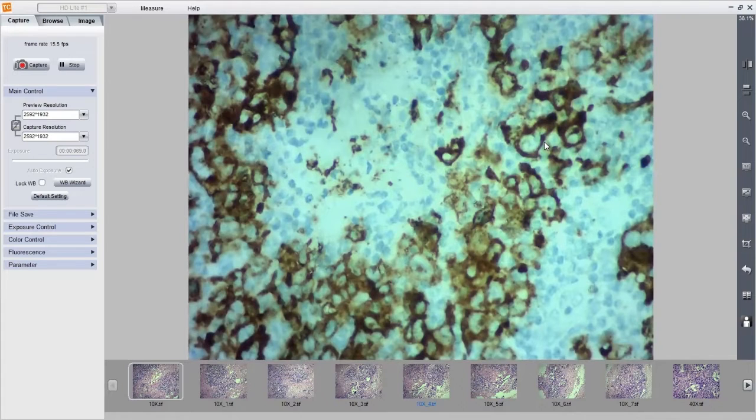CD30 positive. Morphology, I've already diagnosed as nodular sclerosis, and I've just confirmed it with my immunohistochemistry: CD20 negative, but CD15 positive, so I don't have to do anything else. Ideally, what we commonly do is a PAX5. There was a period where we were struggling to standardize our PAX5. That is why in this case I could not show you the PAX5, but there are a few other cases where I can clearly show it. In these cells, the PAX5 would be very dim compared to the reactive B cells, which you will be able to see in the further cases.